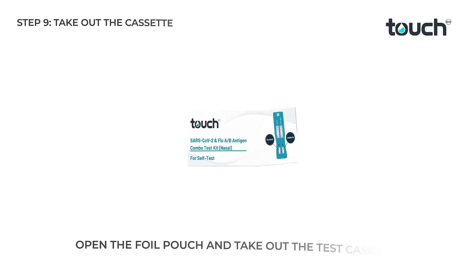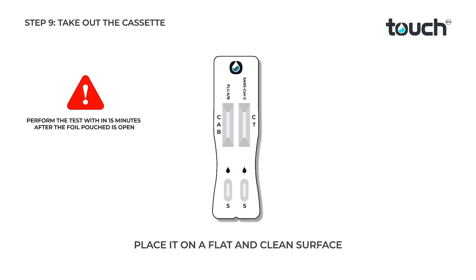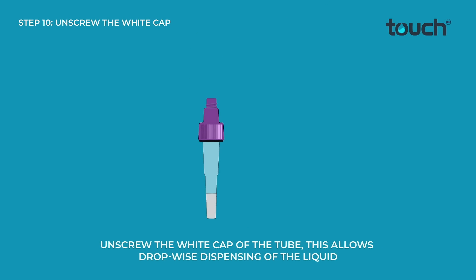Open the foil pouch and take out the test cassette. Place it on a flat and clean surface. Unscrew the white cap of the tube — this allows dropwise dispensing of the liquid.